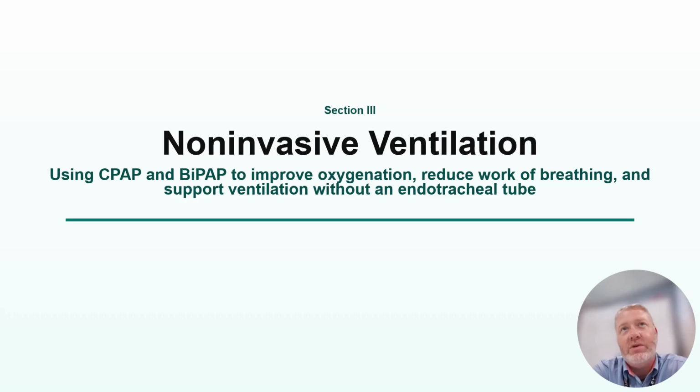There's a ton of studies over the last 15 years about high flow therapy and PEEP. And the latest that I read, the conclusion is that for every 10 or so liters of flow on a high flow, the PEEP delivered is one.